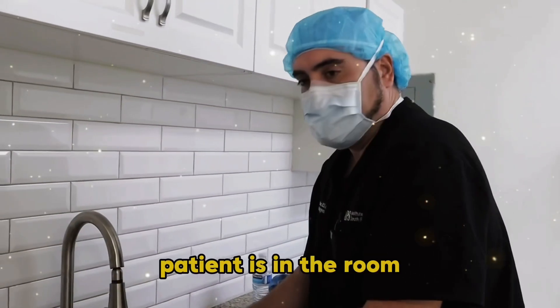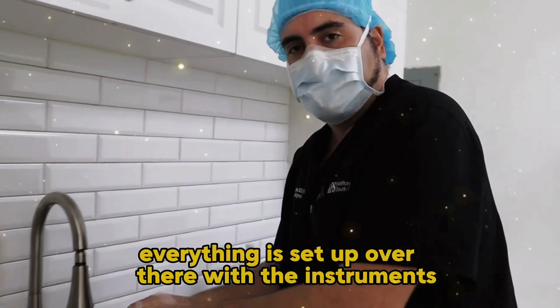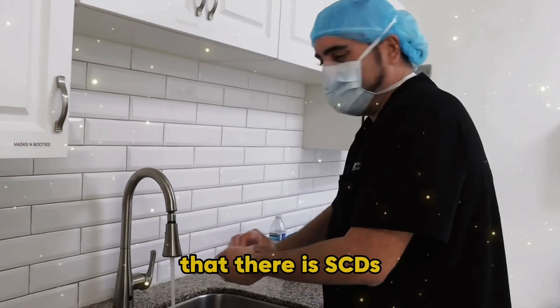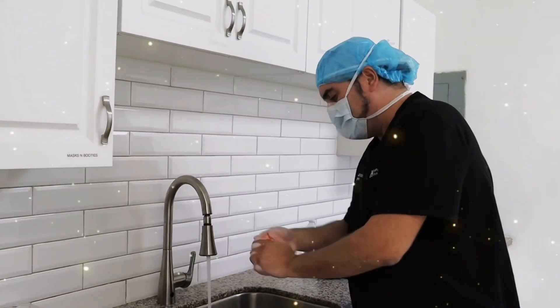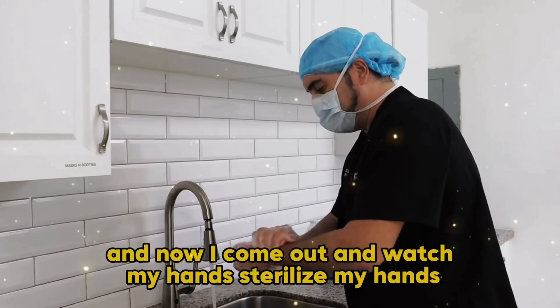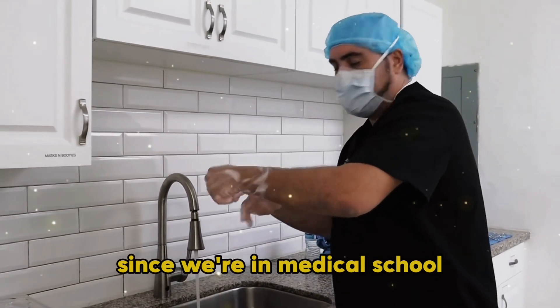First of all, the patient is in the room. Everything is set up with the instruments. You want to make sure that it's heating, that the patient is warm, that there are SCDs — compression stockings. All that has been set up. We position the patient the way we want. And now I come out, I wash my hands and sterilize my hands, which is a routine that we've learned since medical school.